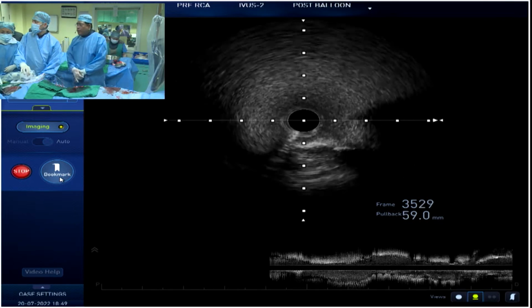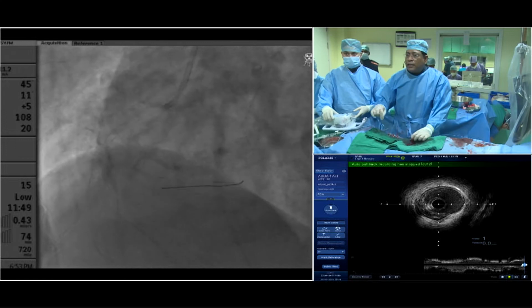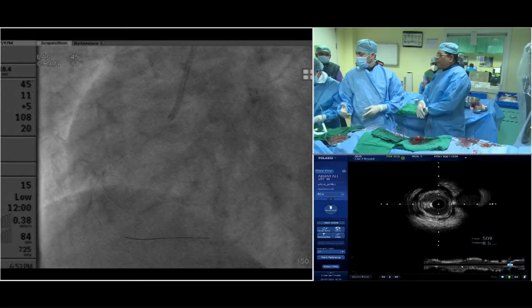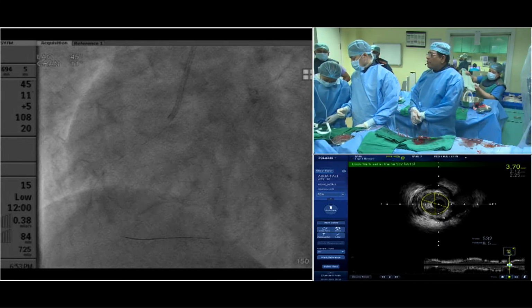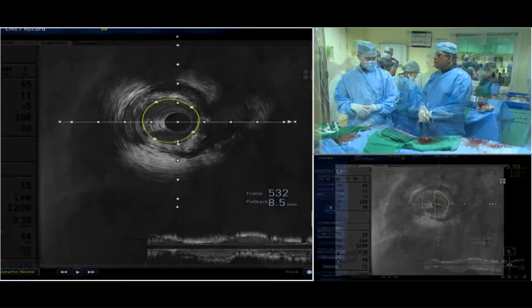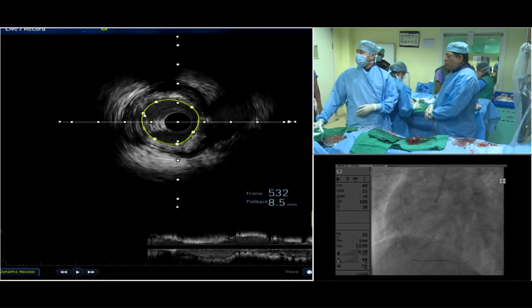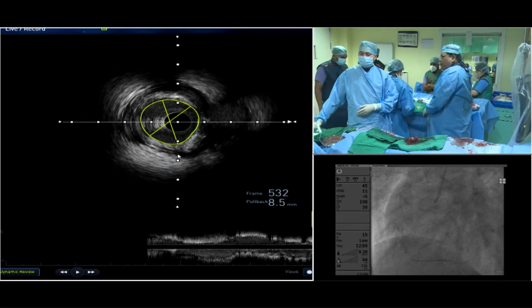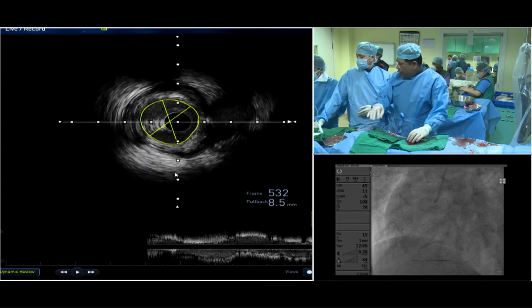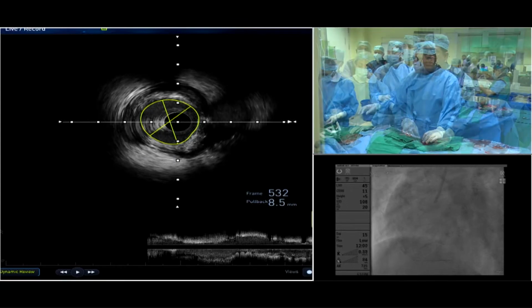Okay, so now we are in. So very important information we have got through our IVUS here in RCA. Very important. Okay, what is the MLA here? 3.7. So let's go with a FFR. Okay, give me FFR where? Yes, 3.7 is not bad. It is closer to 4, and 3.8 it is there. Yeah, 3.5, 4. It's a very borderline. IVUS FFR shows the FFR.